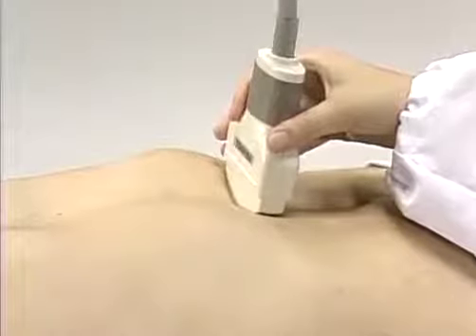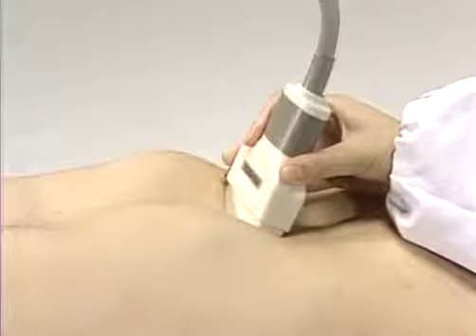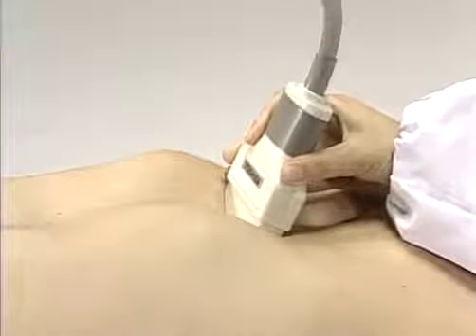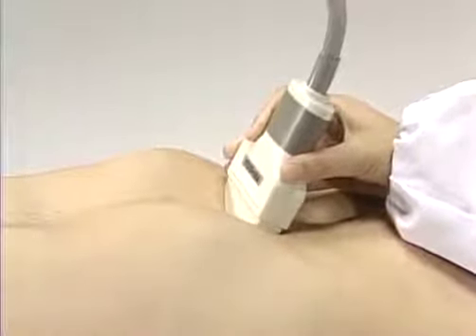To visualize the pancreas, press down on the probe rather forcefully, then tilt the probe tip slightly upward to expel gases from the stomach. However, if the patient is lean, do not press too hard on the probe because if the pancreas is compressed, the image becomes hard to see.